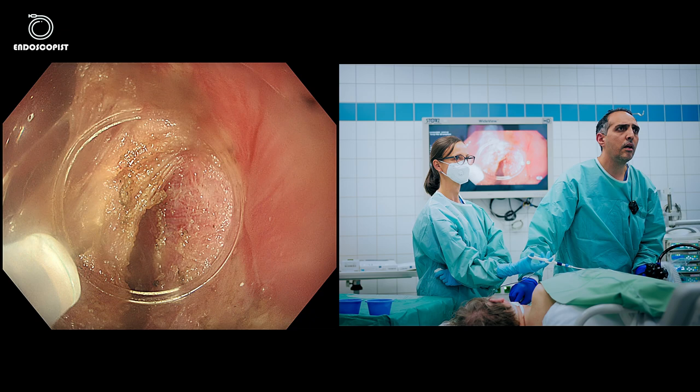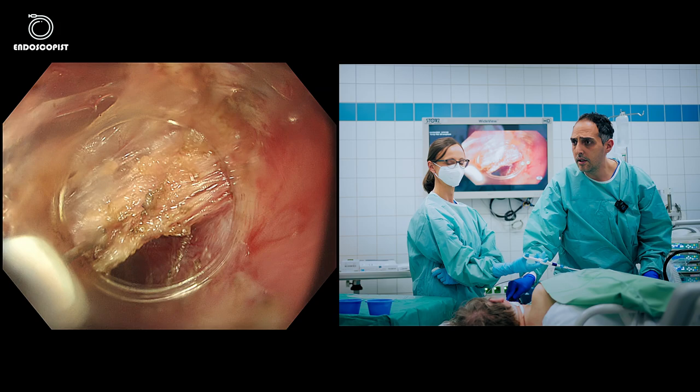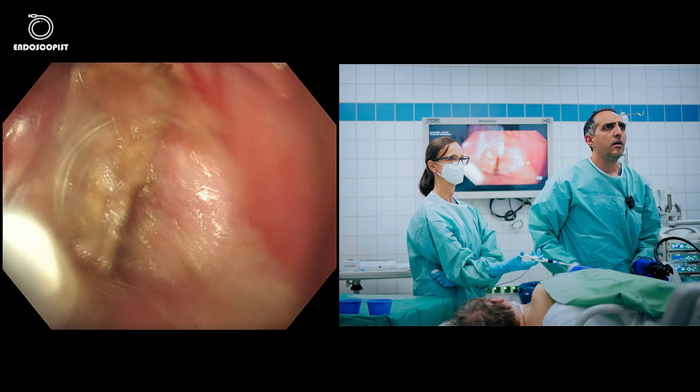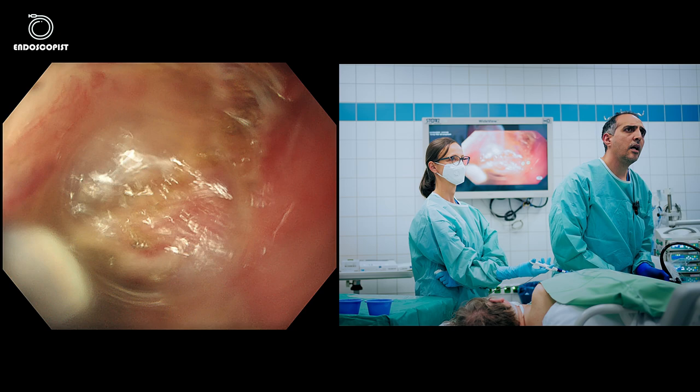Let's try another mode called Precise Cut from Erba to see the difference. It's a little slower than the other modes but more precise. To be honest, I don't like it for myotomy, so I'll switch back to spray coagulation.